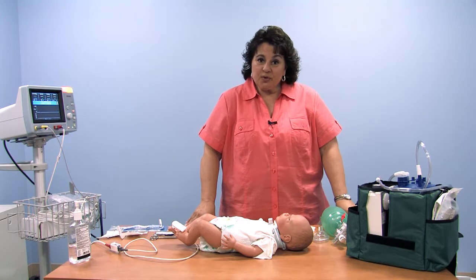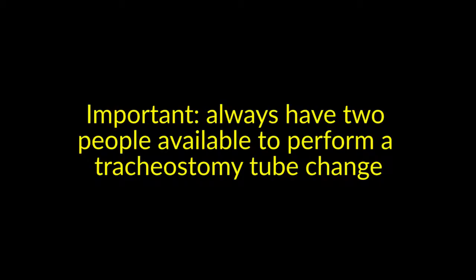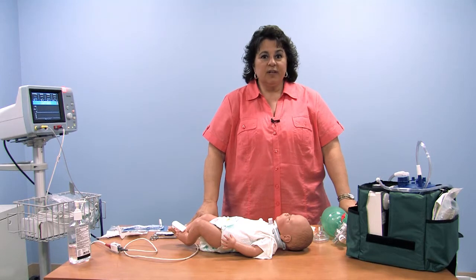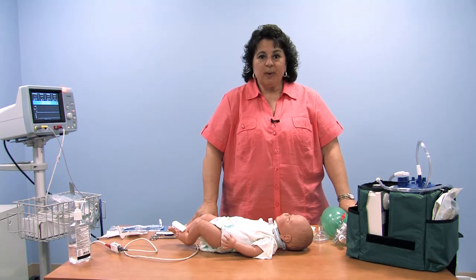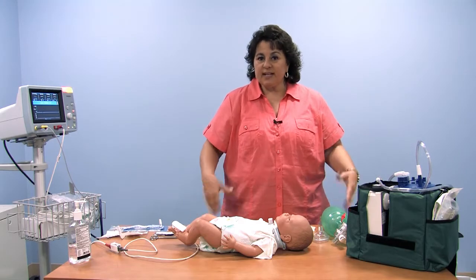What we first want to do for this elective tracheostomy tube change is assure that we have two people. So you see me here today, but I have a second person doing this with me. We don't do tracheostomy tube change electively with one person. It's always a two-person procedure. In an emergency, certainly you do what you must to get the tube back into the child for safe transition to spontaneous breathing.